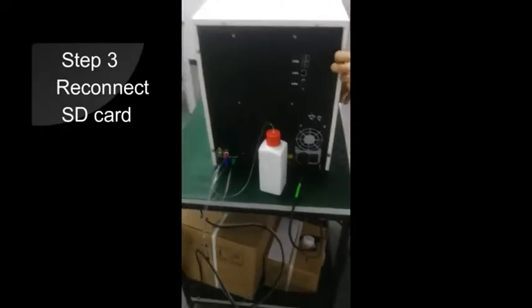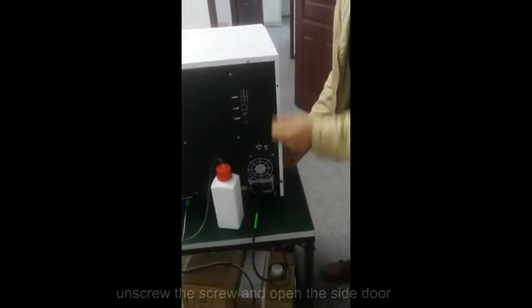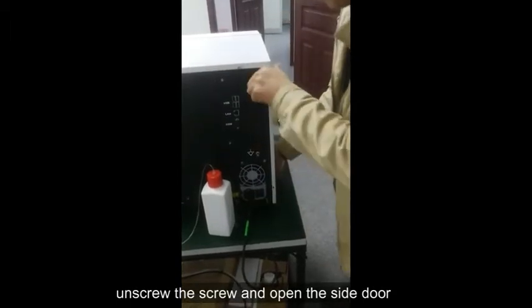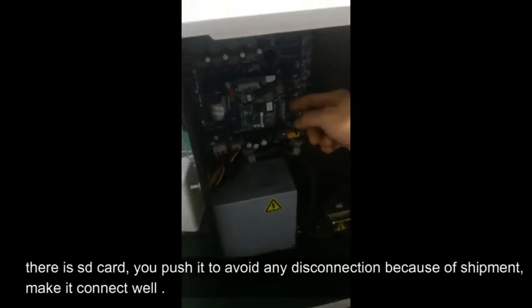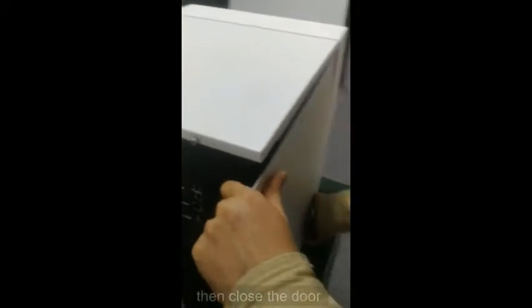Step 3: Reconnect the SD card. Unscrew the screw and open the side door. There is the SD card — push it to avoid any disconnection that may have occurred during shipment, and make sure it is connected well. Then close the door.